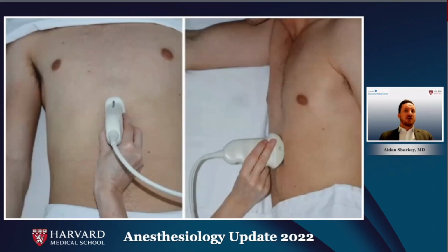In terms of patient positioning, both supine and right lateral decubitus positions may be used to locate the gastric antrum. In the supine position, large quantities of gastric content will be readily visualized in the gastric antrum, but smaller quantities may remain within the gastric fundus. In contrast, the right lateral decubitus position encourages gravitational drainage of gastric content to the dependent antrum and increases the sensitivity of ultrasound to detect smaller volumes. If the patient is unable to turn to his or her side, then a slight head-up position can also be used.